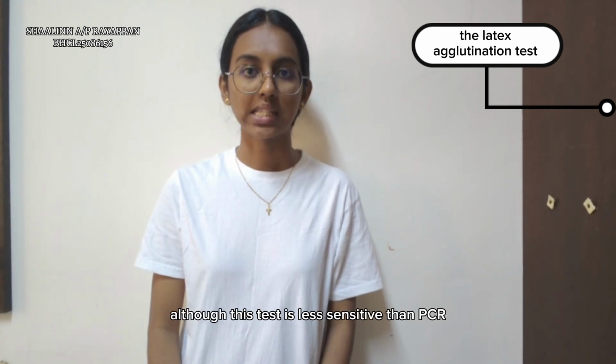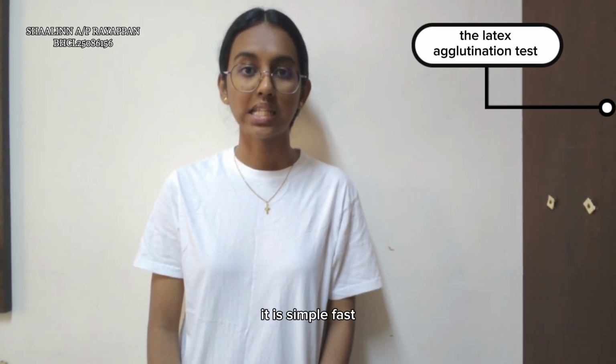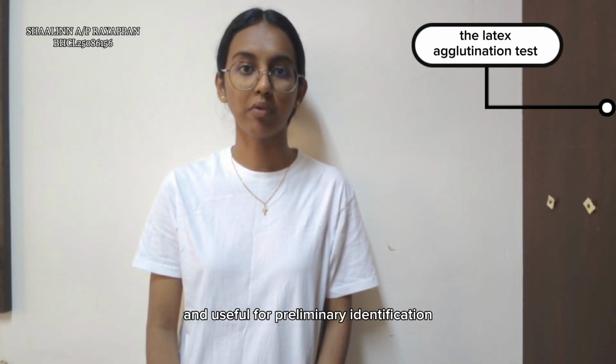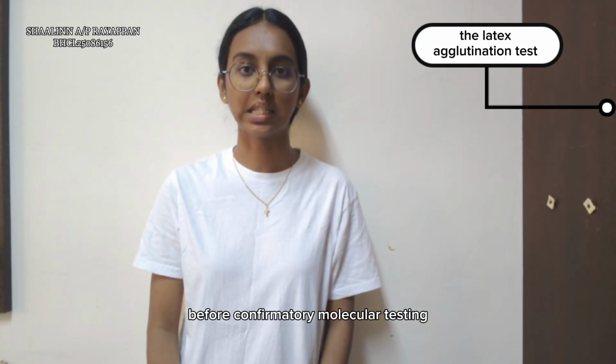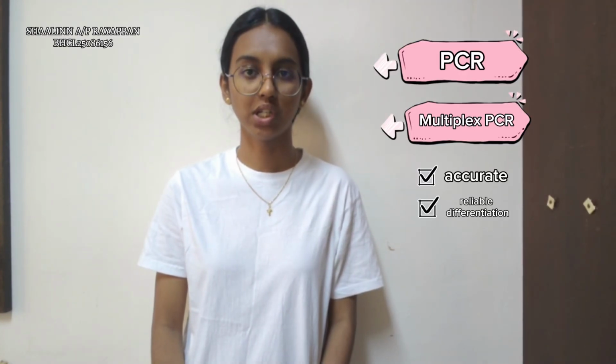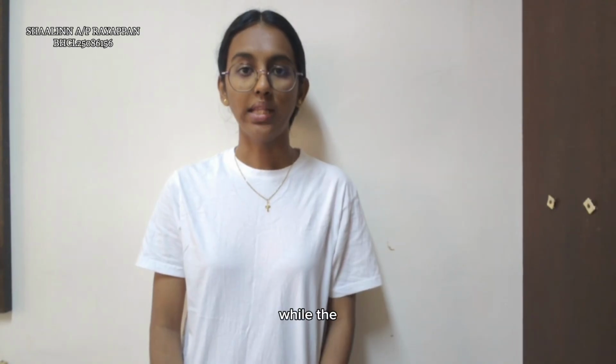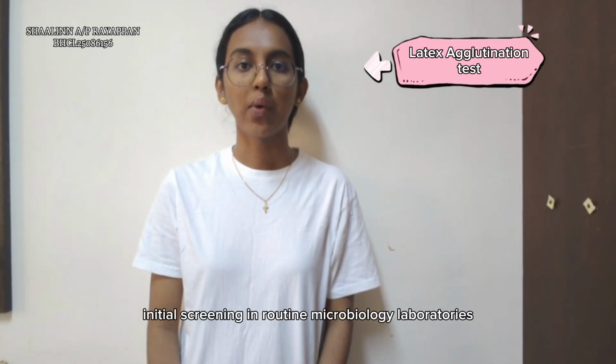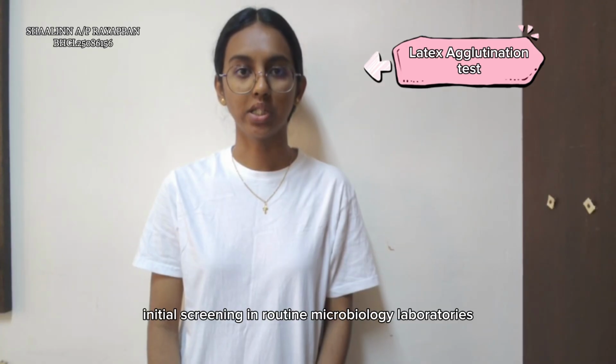Although this test is less sensitive than PCR, it is simple, fast, and useful for preliminary identification before confirmatory molecular testing. In conclusion, PCR and multiplex PCR provide accurate and reliable differentiation at the genetic level, while the latex agglutination test offers rapid initial screening in routine microbiology laboratories.